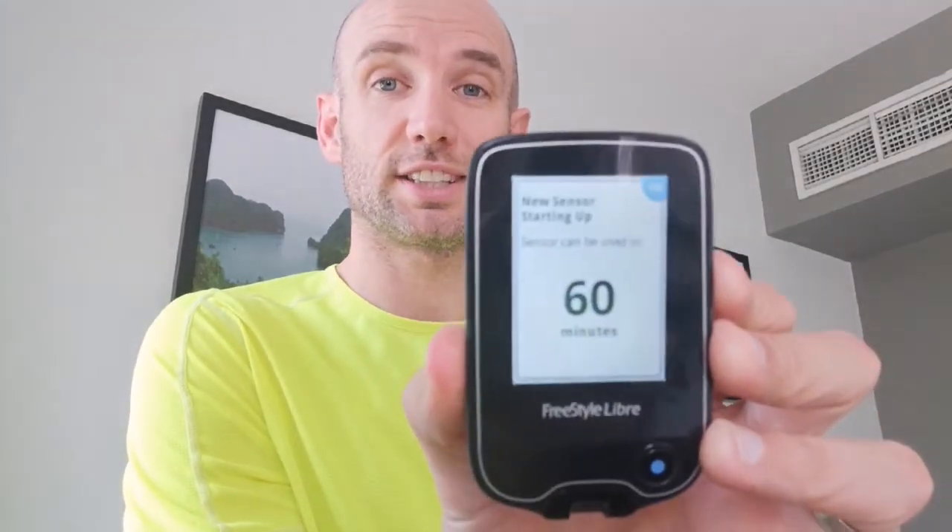And here we go, the moment of truth. It wants me to start a new sensor — new sensor to start — new sensor starting up: 60 minutes.